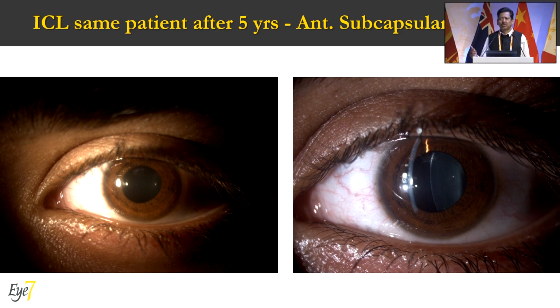So it took another 5 years for the cataract to come to a little distance in the middle, and that is when we decided that we'll do a cataract surgery. The patient didn't mind. He had enjoyed the best part of his life, 10 years without glasses, had a very high number, and the surgery was uneventful.